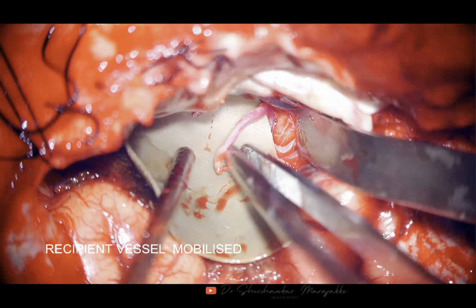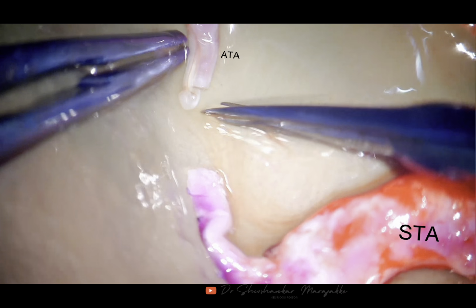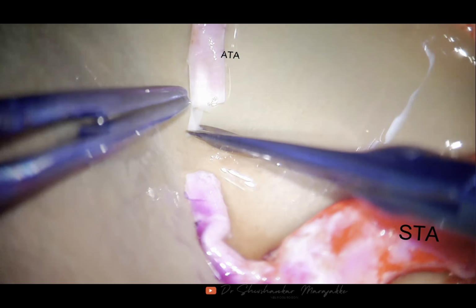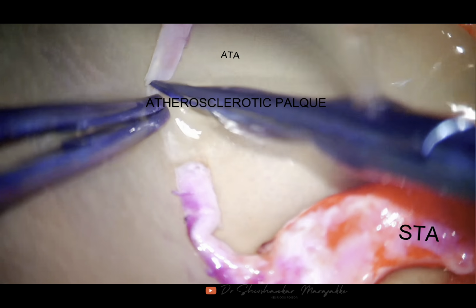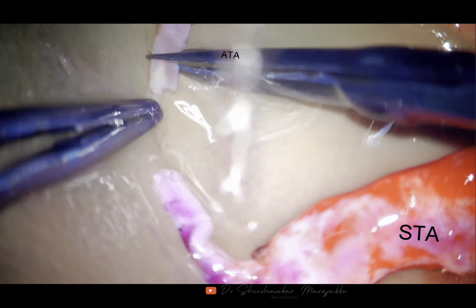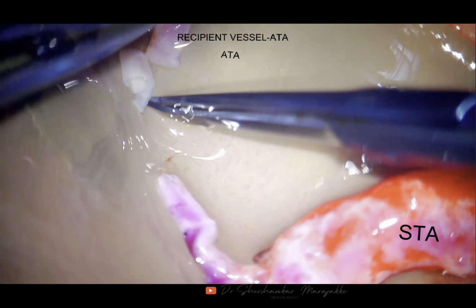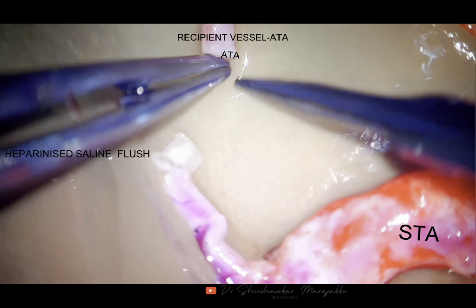There is one vessel arising distal to the division. You can see a white streak, and that is the atherosclerotic calcified part which is extending even into the origin of the antetemporal artery. So this is not a good site for anastomosis. So I just prepared this vessel. Transverse cutting we have to do.